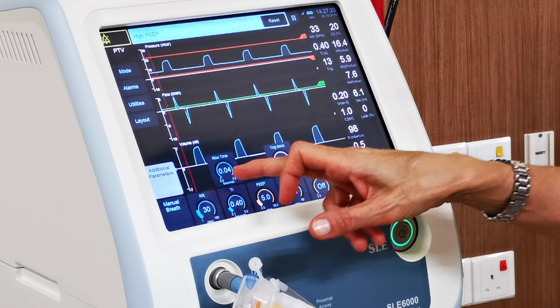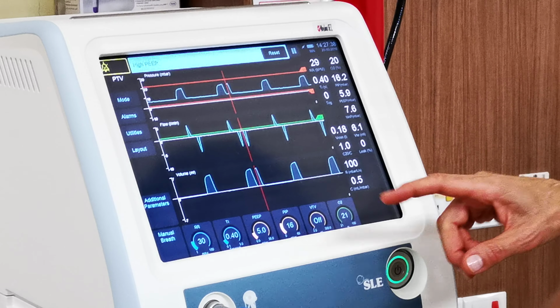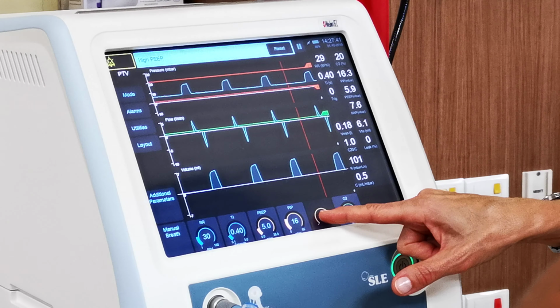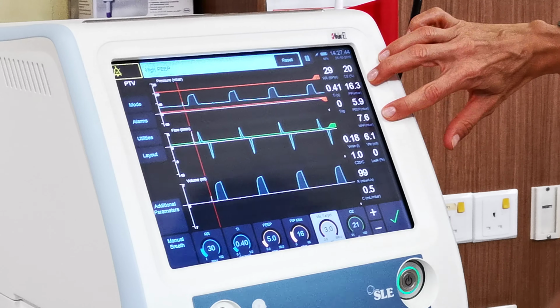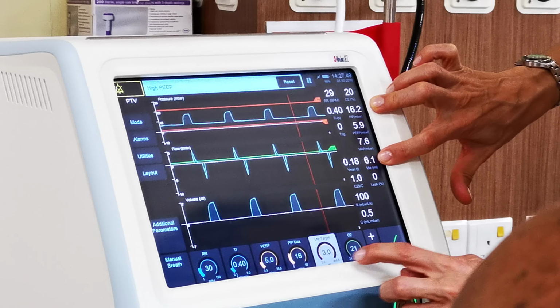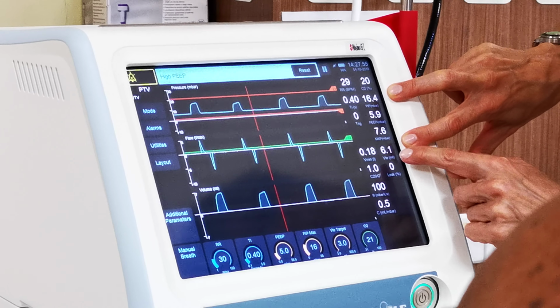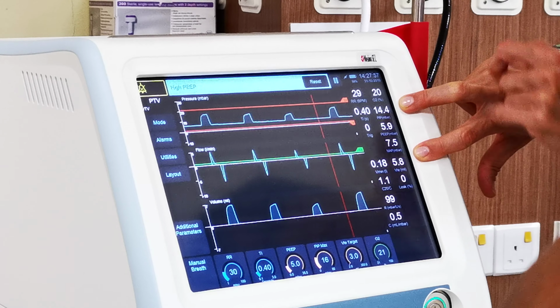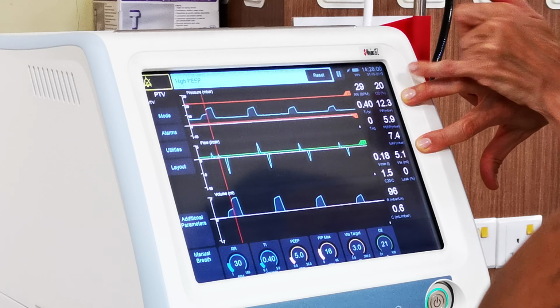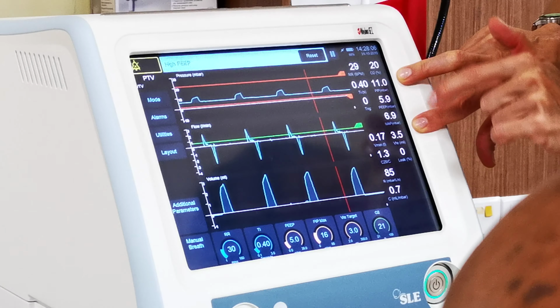So, for example, here currently what is happening, my ventilator is using 16 of pressure and is delivering 6 of tidal volume. Let's say that for my patient, I want only 4. So look here at the same time, the PIP and the tidal volume. So here I tell the ventilator, I want 3 milliliter. Okay, confirm. Look what the ventilator is doing. Here it is pushing 6, so too much. So you see what it's doing is decreasing your PIP to get your tidal volume right. Decreasing the PIP. Okay.